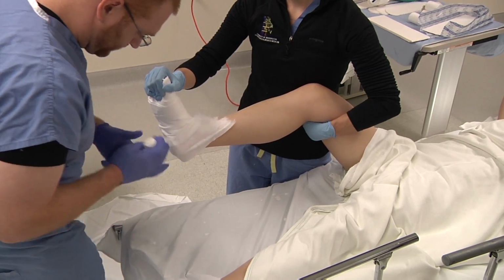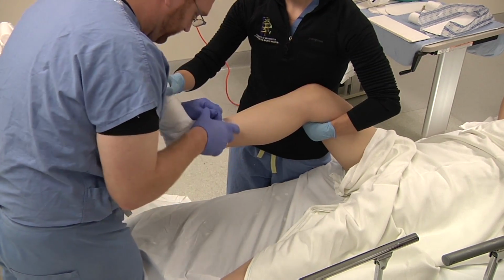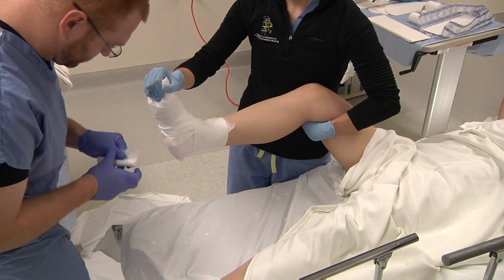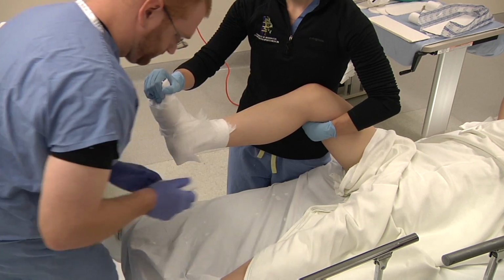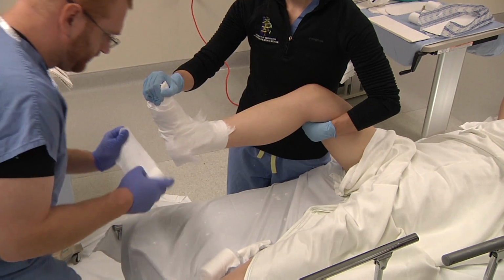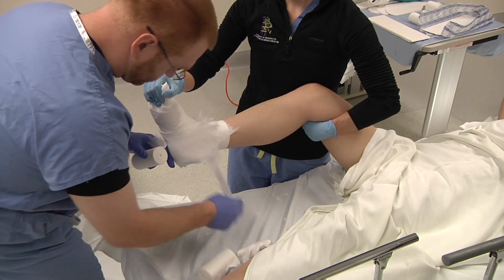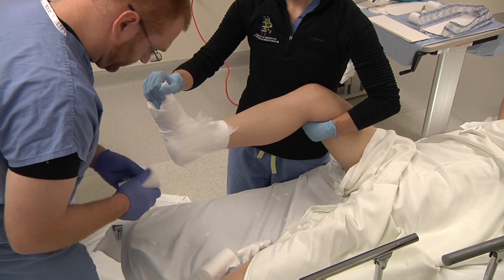You are the boss of the web roll. You can tear it any way you possibly need to avoid getting excessive wrinkles, which can actually cause pressure points. Pay special attention to those potential pressure points, including the heel, the medial and lateral malleoli.